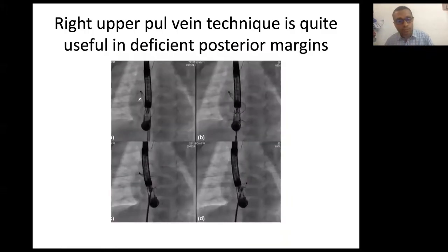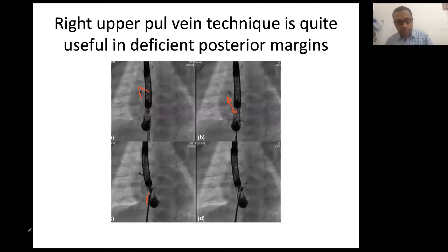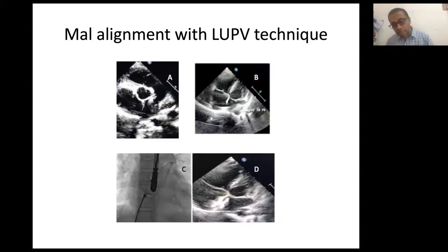In the RUPV technique, the device gets anchored into the pulmonary vein, then the RA disc is deployed. Once the RA disc is confirmed on the right atrial side, you give a vigorous pull to the delivery cable to unanchor the tip of the LA disc and then position and release the device. This is a case where transthoracic imaging guided pulmonary vein deployment is shown — the device is visible in the pulmonary vein and the operator has a clear understanding of both device length and LA size.